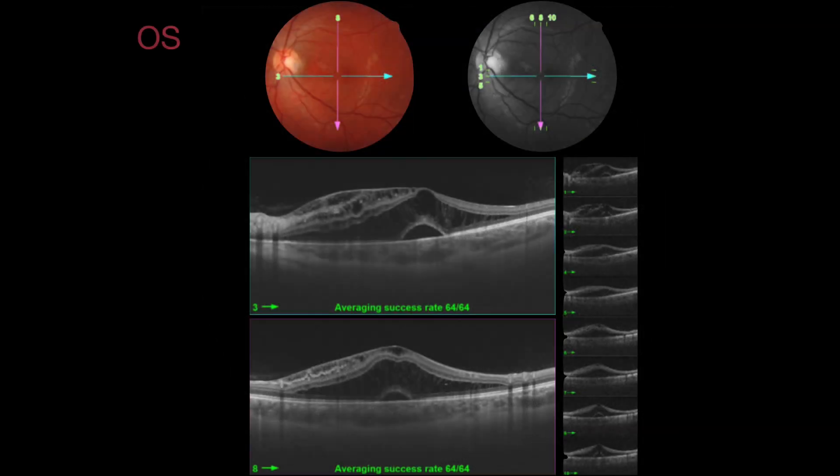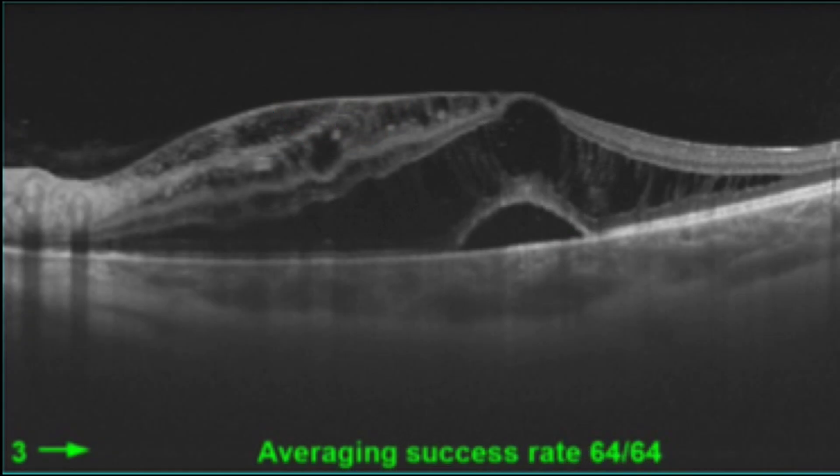In the OCT scans it was possible to see the vitreous attachment to the optic nerve head and the presence of a dense fibrous tissue attached to the optic disc area. Furthermore, the patient had intra-retinal and subretinal fluid and macular changes.